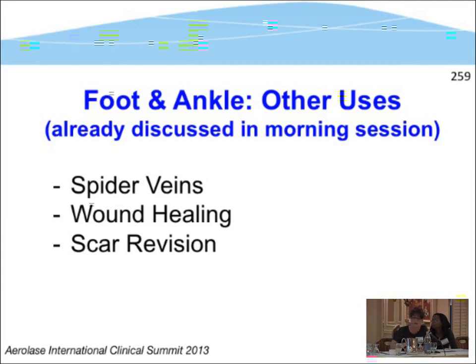Once I got her closed, I did do sclerotherapy. I did do a Doppler on her immediately, just so you know, because I'm medical-based as well, and we worked routinely with wound care and compression, and she couldn't tolerate an Unna boot, so I did this twice a week with her, and she did phenomenal. I mean, this woman walks around singing my praises because she was so lost and couldn't do anything.